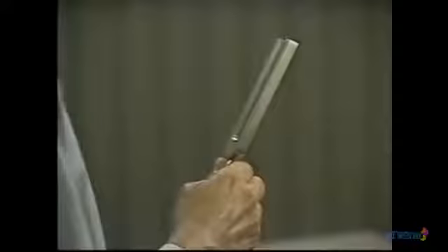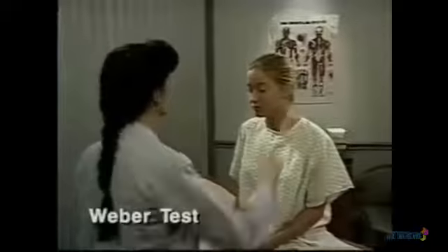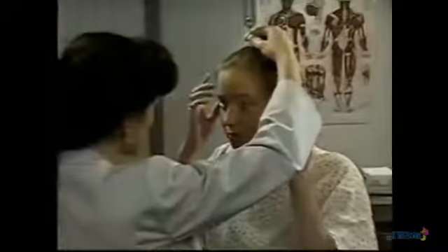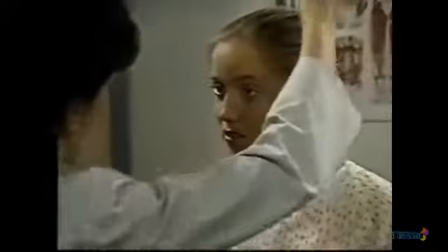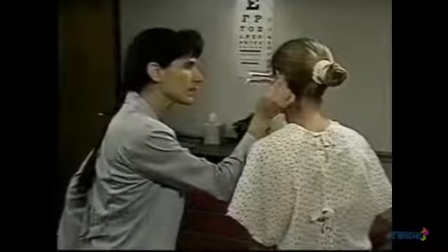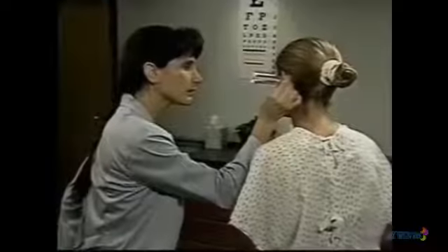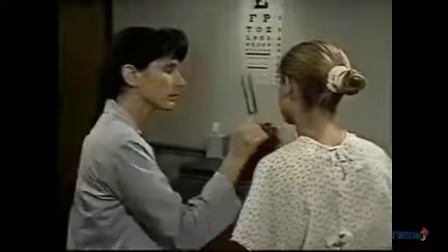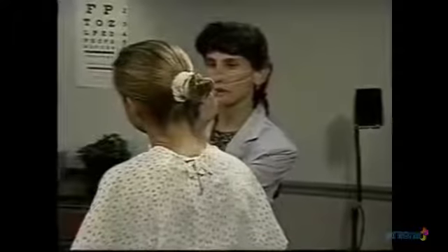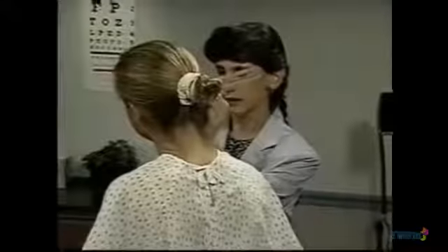For each test, use a relatively high-pitched tuning fork, such as one of 512 Hertz. To do the Weber test, place a lightly vibrating tuning fork firmly on top of the patient's head. Ask where the patient hears the sound, normally in both ears or the midline. To do the Rinne test, place a lightly vibrating tuning fork on the mastoid bone behind the ear. When the patient indicates that the sound is no longer heard, quickly place the vibrating fork close to the ear canal. Normally, the patient can hear vibration longer through air than through bone. Can you hear this? Repeat the test on the other ear. Tell me when it stops.